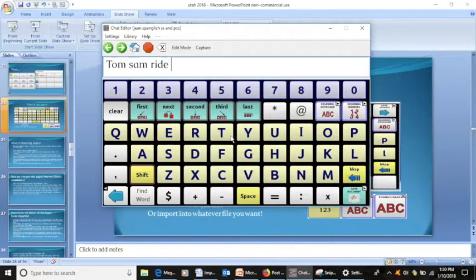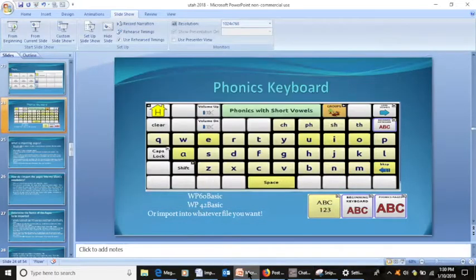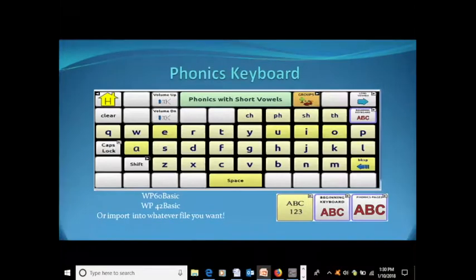I know somebody just recently here changed every single letter for a kid because that was what they wanted. And of course at the time I was like, oh, we talked about doing it, but of course it was there. So, yeah. That's the Phonics keyboard.